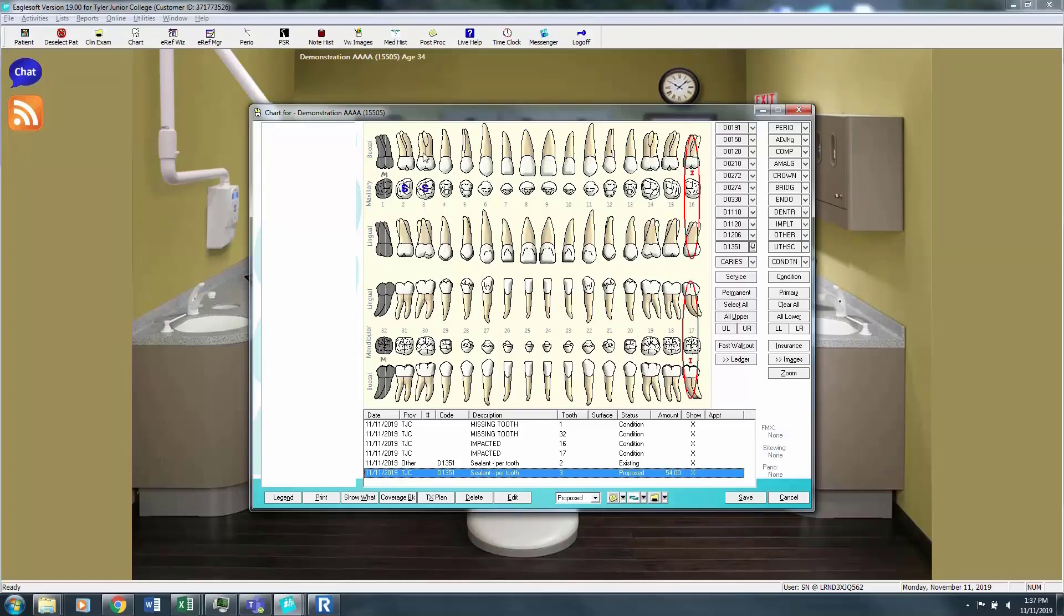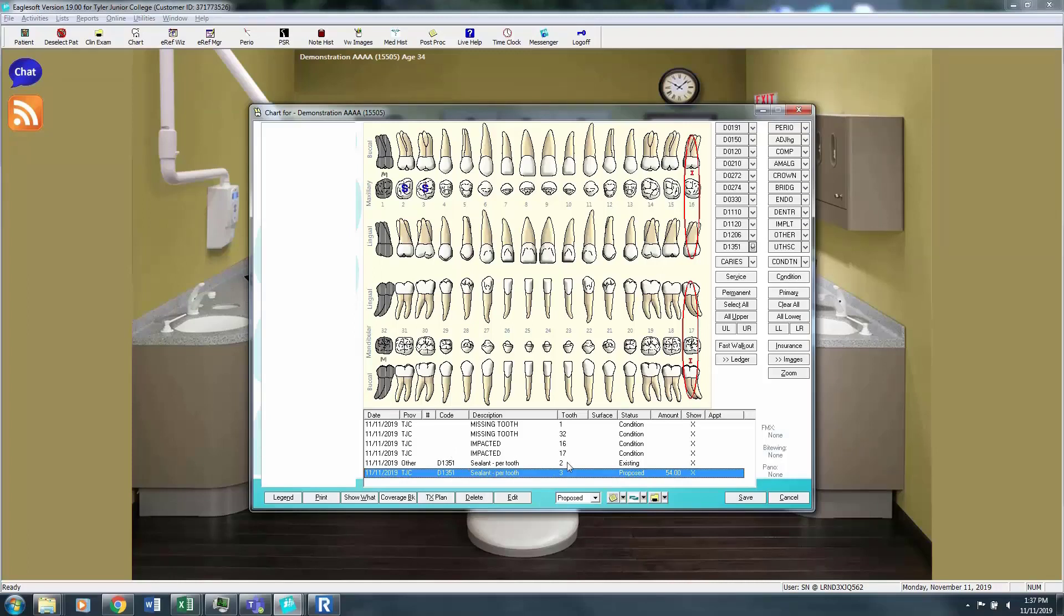Though it may be difficult to tell in the video, the existing sealant has charted with a solid blue S and the proposed sealant has a blue S with red lines through it. So I know that that sealant has not been done yet. I can also confirm that by looking down here in the dialog box and see that tooth number 2 has an existing sealant and tooth number 3 has a proposed sealant.